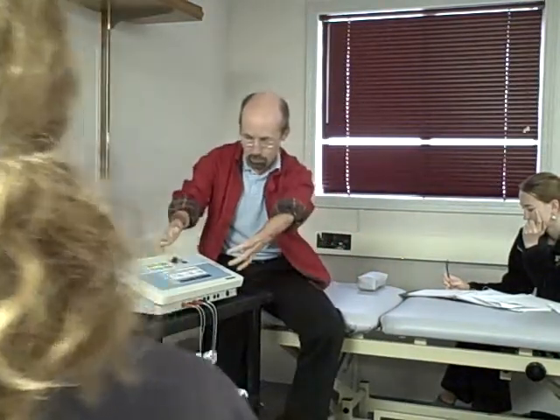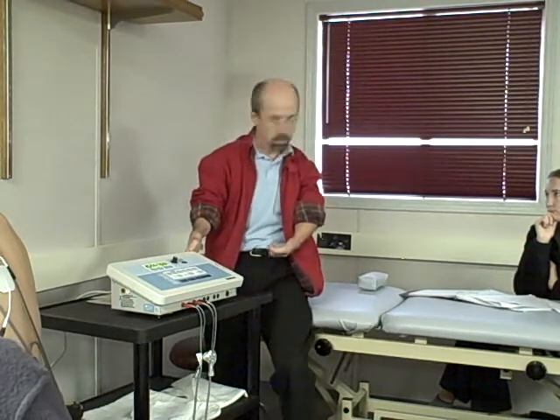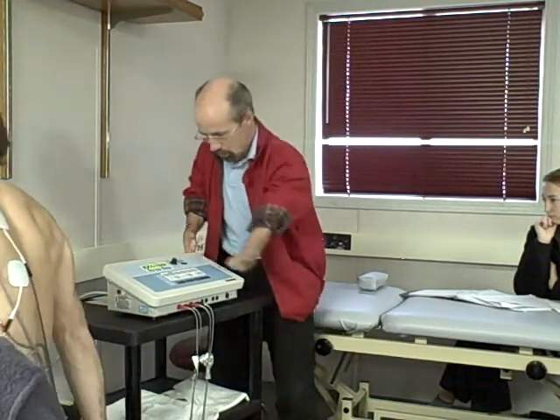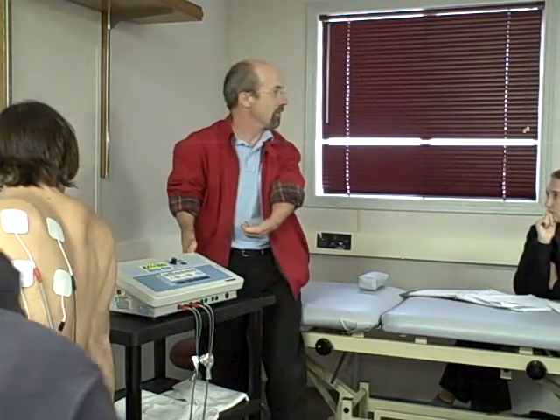Again, most of the brands, most of the boxes work the same way. There are other parameters, but it's 1, 2, go. Hit the waveform, set the intensity, and go. So, hit the waveform, I press quad polar. On this particular machine, it's flashing intensity, which is telling me I can set intensity now.